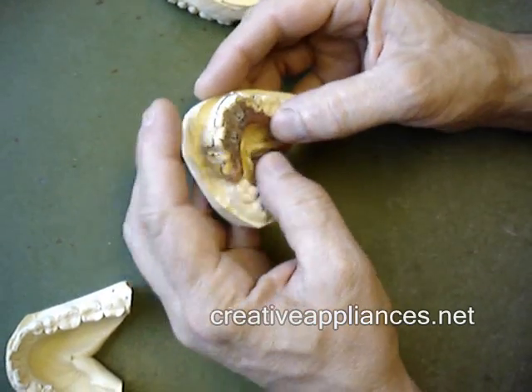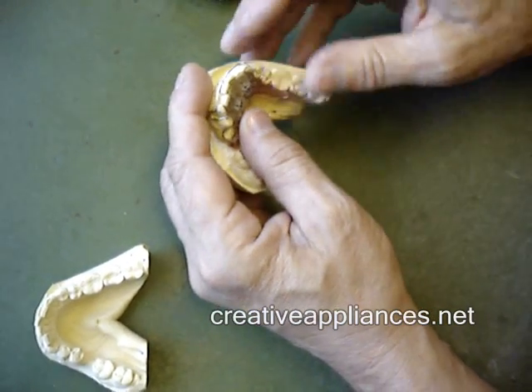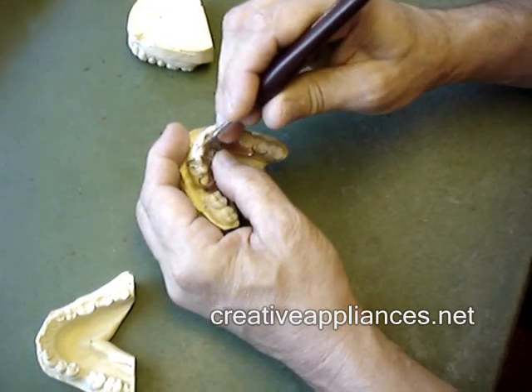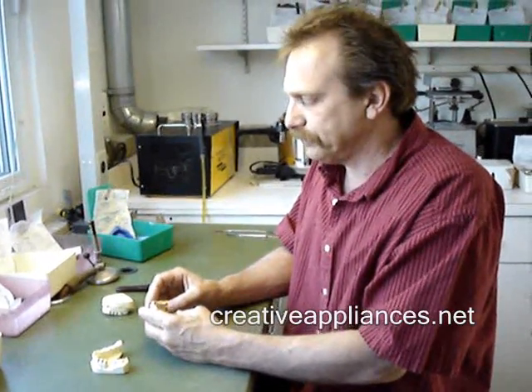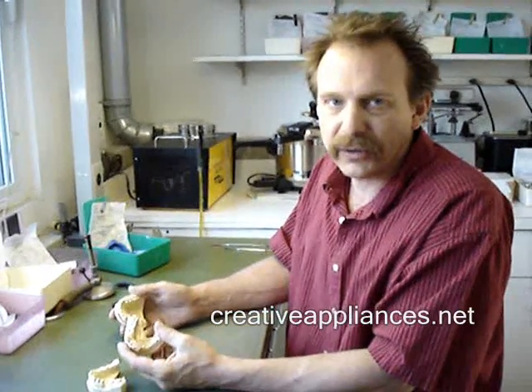Eventually, upon wearing this appliance and activating these screws with a key, the laterals as well as the left central will be pushed out to meet the bow. In a matter of eight to ten weeks, depending on compliance — and compliance is everything — she should be lined up very nicely and have a beautiful smile on her lower to match the upper that she's already got.